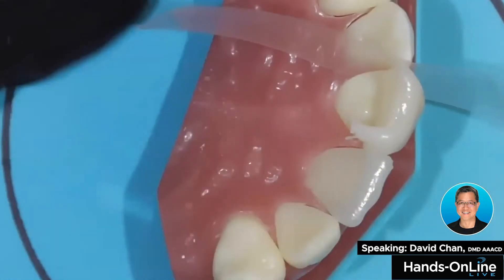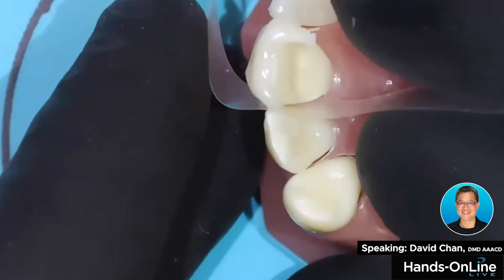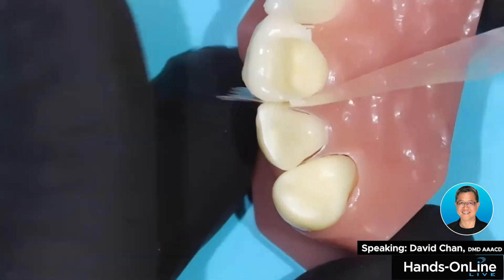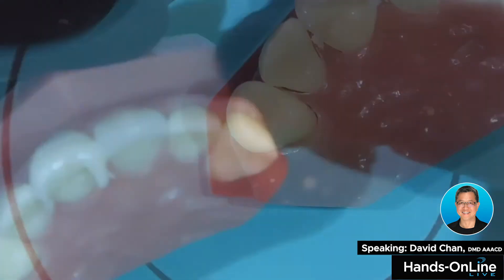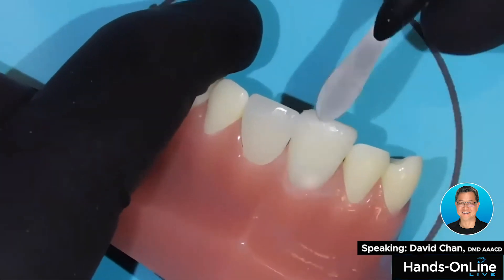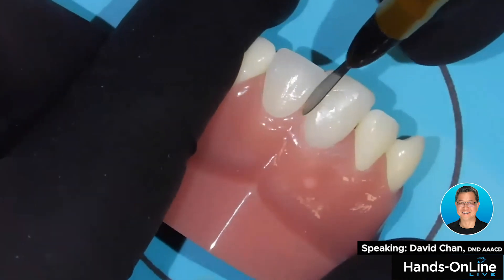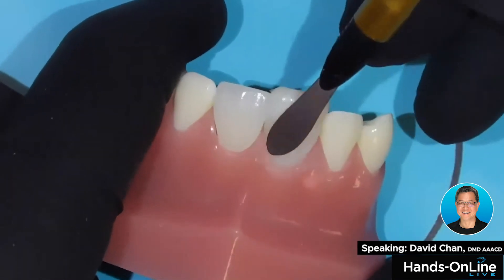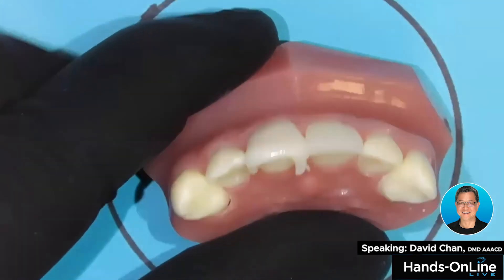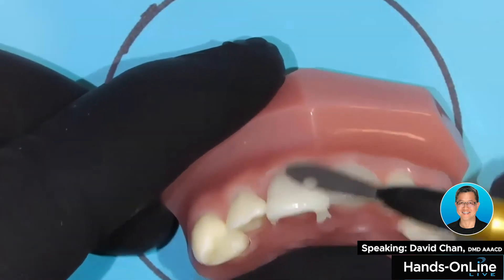You see how that dragged it in there. And I'm going to get the other one — bend it here. There. I have a very intimate contact there. I'm just using this instrument to spread this material. It's nice, doesn't slump. You see I'm dragging the excess to the incisal, and I can reference to the adjacent tooth. It's a little over-contour, which is fine, but the shape is forming and the line angles are being formed.